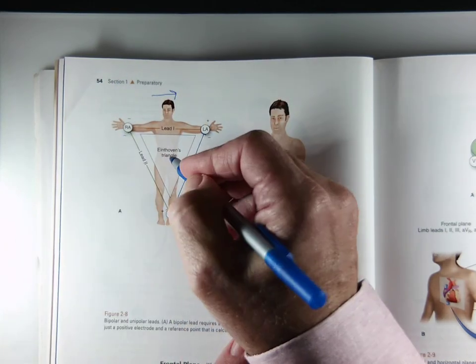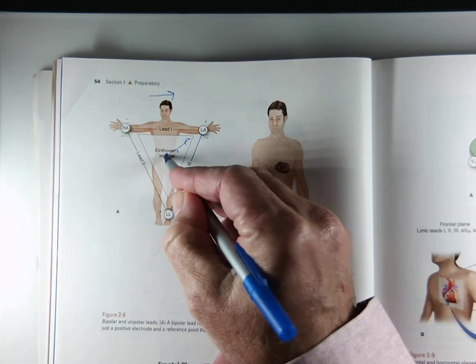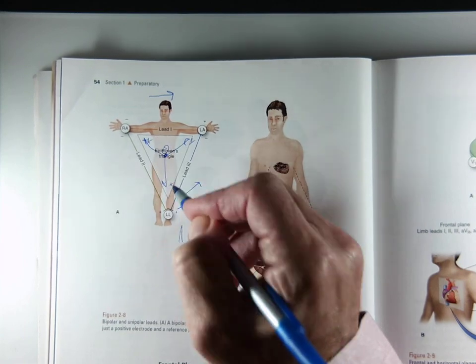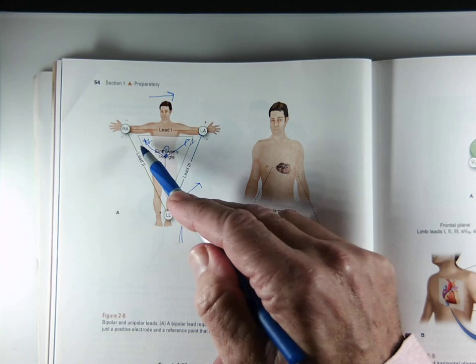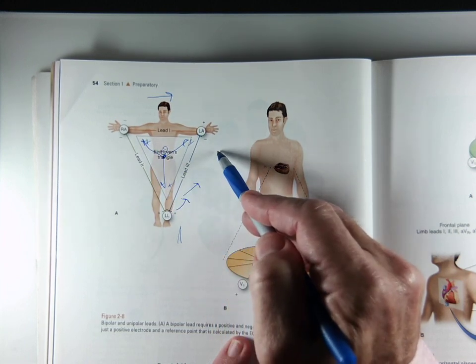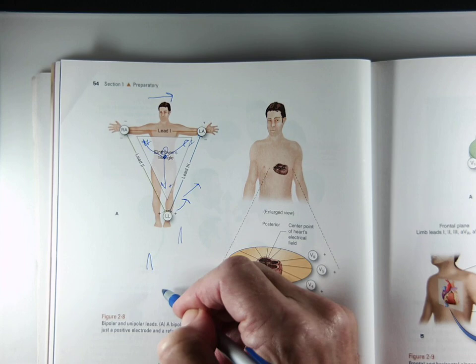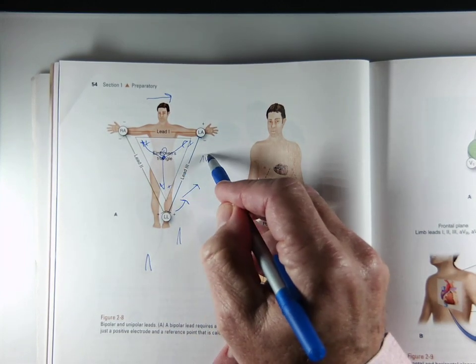Okay? Then remember the augmented leads go to the left arm, to the right arm, and to the feet, with the precordial leads here in the middle. This is always negative. These are always positive for the augmented leads. So once again, normally we have electricity going from right to left, okay? And we usually have electricity going down to the feet. So typically in AVF, we would have an upright R wave as well as in AVL, okay?